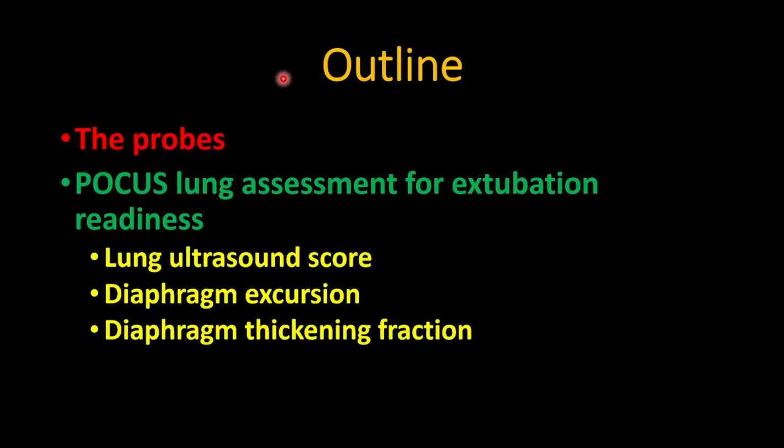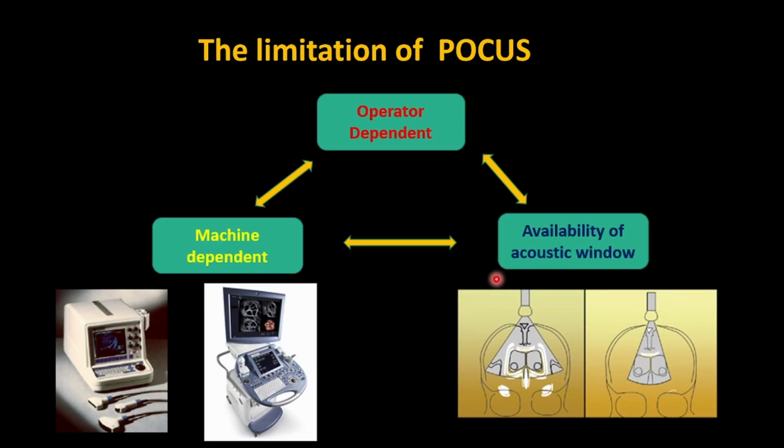All in all, we have gone through the probe and three important ways of how to use point of care ultrasound in assessing extubation. But one has to always remember, POCUS has limitations. It is operator dependent, machine dependent, and depends on the availability of an acoustic window.